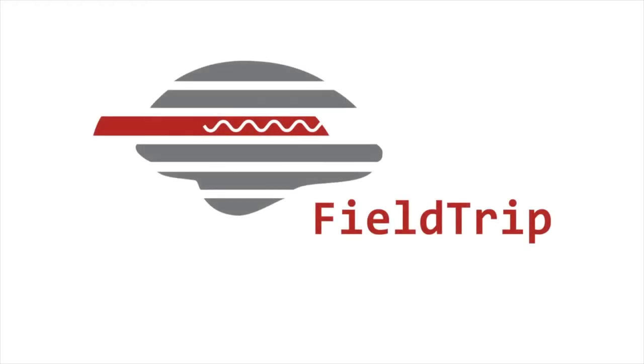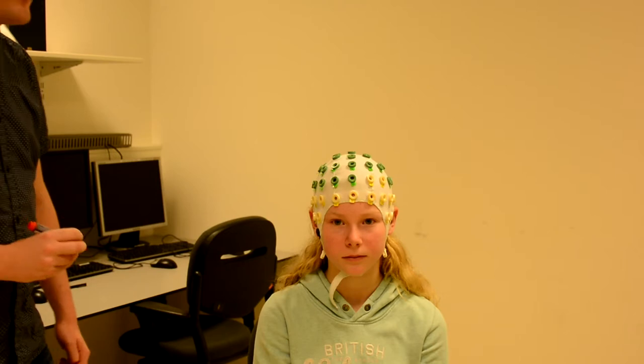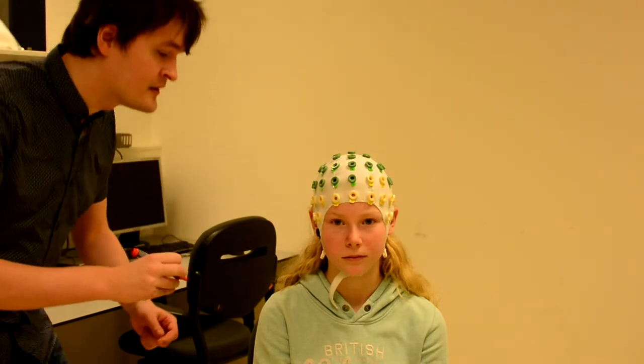Welcome to a Fieldtrip Toolbox video. You can visit us at fieldtriptoolbox.org. Welcome to the Fieldtrip Toolbox, where we learn how to use the Structure I.O. sensor to localize electrode positions.